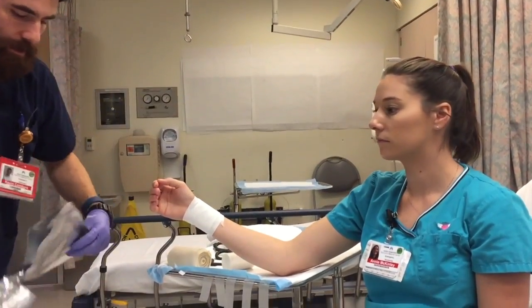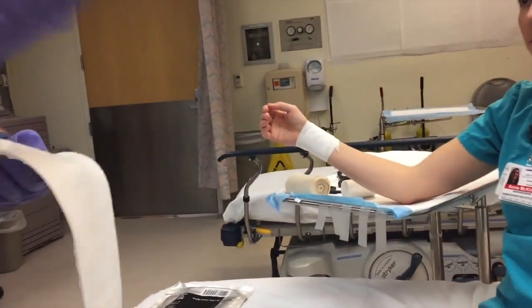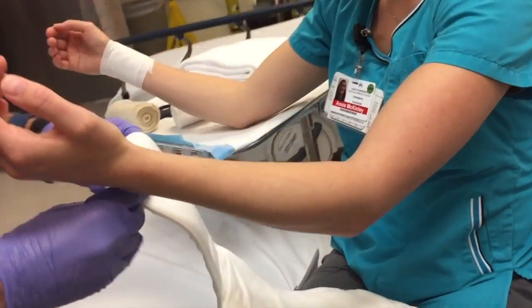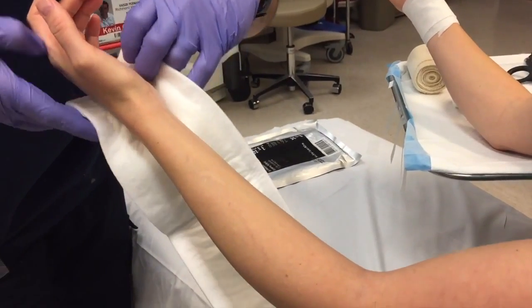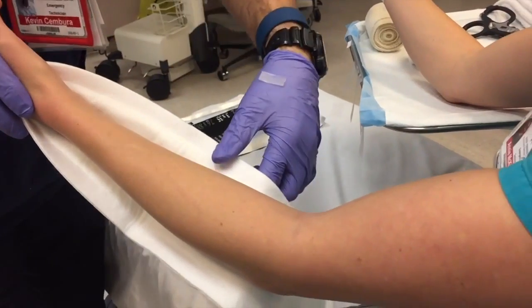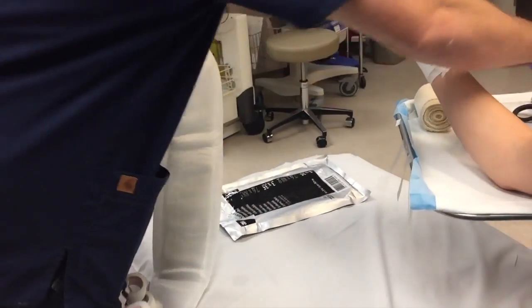Splinting material, and you size it, and on a true patient, you'd want to size on the opposite side so that you're not causing any undue pain. So we're going to go about where the fingers bend here, come down about there. Only need to go maybe three-quarters.